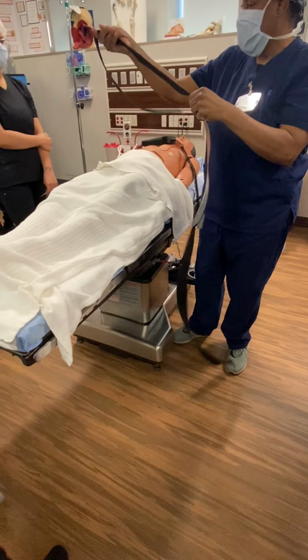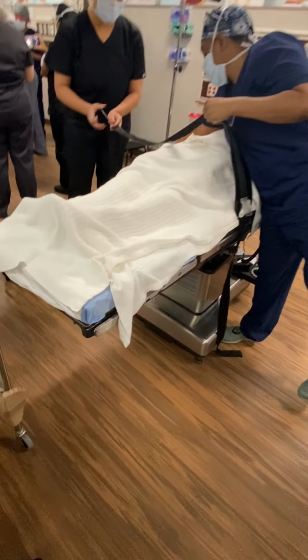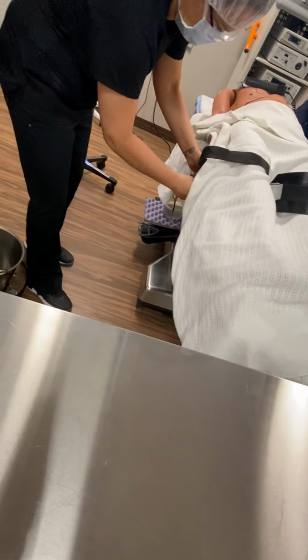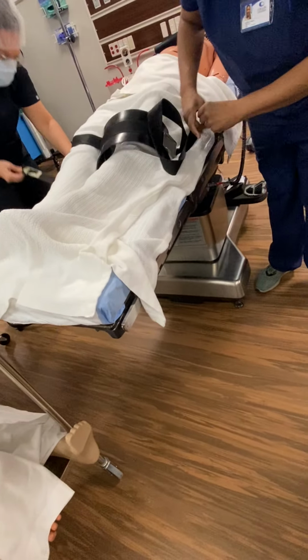You don't have to tuck all of this. You can just tuck this part, fold it over in between one of these little things right here. Press a little bit right down here. Just bring that down and in, and then bring it up. Okay, I don't put it over the wrist, and I always make sure I'm over the thighs, okay?